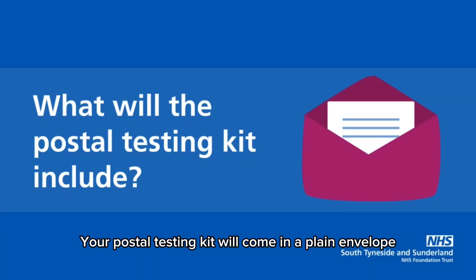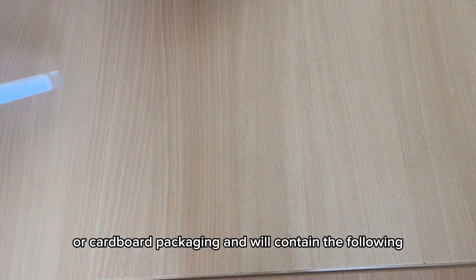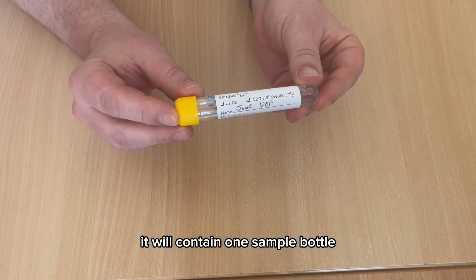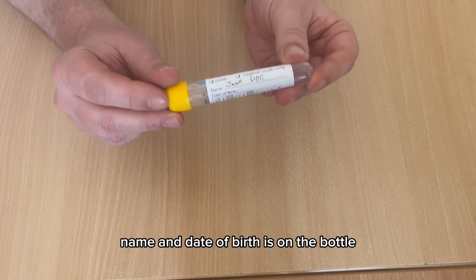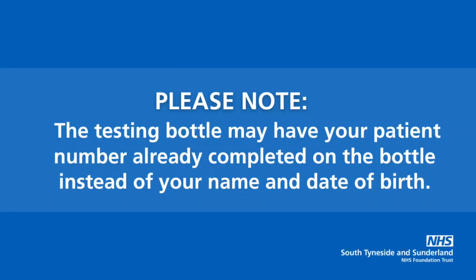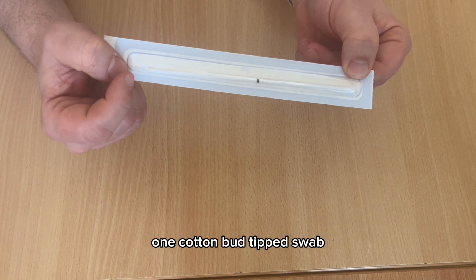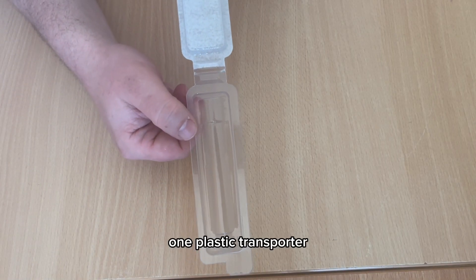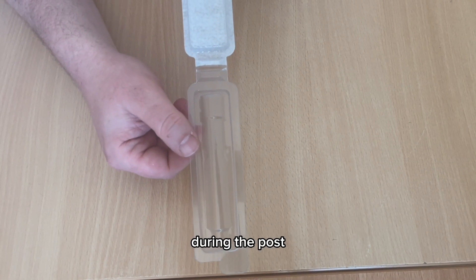Your postal testing kit will come in a plain envelope or cardboard packaging and will contain the following: one sample bottle — please make sure your name and date of birth is on the bottle; one cotton bud-tipped swab; and one plastic transporter, which is used to make sure there is no damage to your sample during the post.